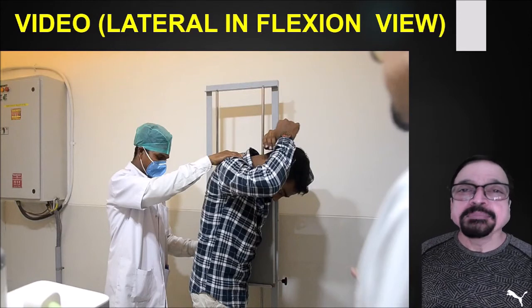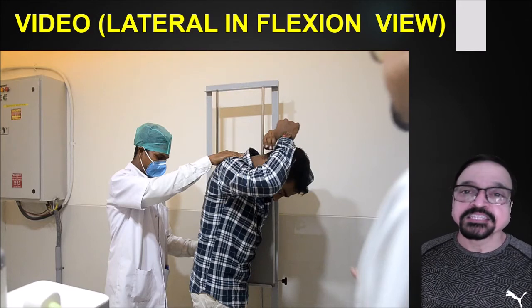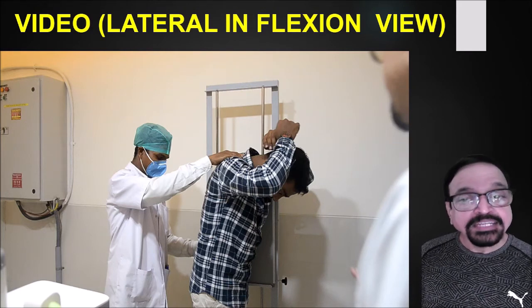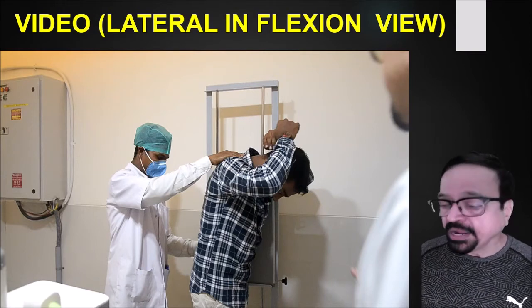Routinely, lumbar AP and lateral are enough. The additional X-rays like flexion, extension are taken only when instability is suspected. Now, dynamism is an advantage of X-rays over MR. Dynamism is you can take the flexion and extension to know whether there is any movement.